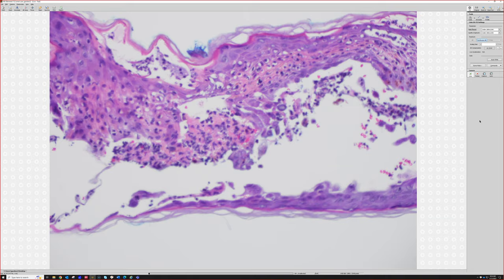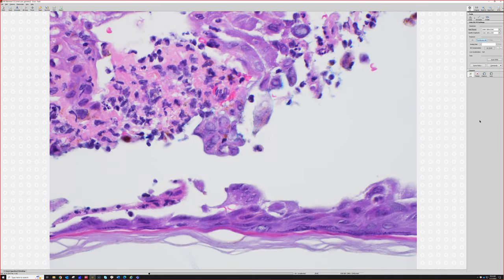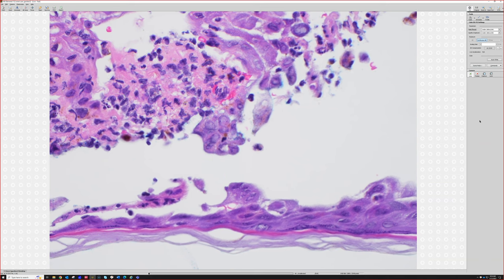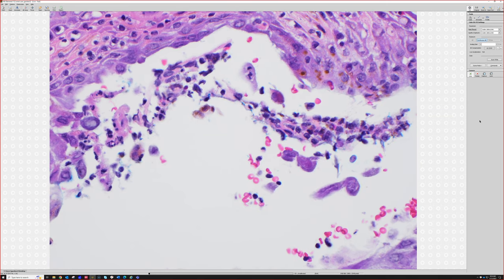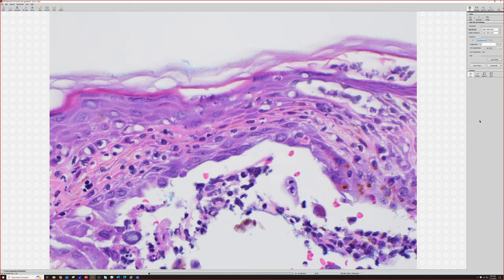So in this case, we have multinucleation, not great molding, and we've got a bit of that smudgy, pale kind of nuclear chromatin. But admittedly, this is not the most textbook perfect image. And then we have acantholysis, and what I mean by that is free-floating cells that are rounded up. The keratinocytes are detached and are rounded up. So anytime I see a blister with acantholysis, with neutrophils, with dirty necrosis, I start looking for herpes. And of course, your clinical suspicion is important too. And in difficult cases, you can do immunostains if needed.